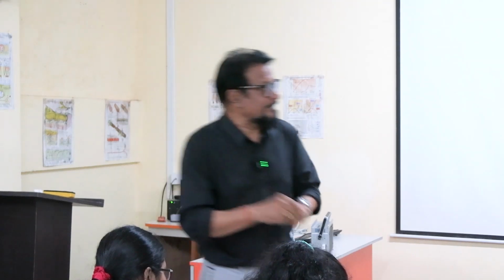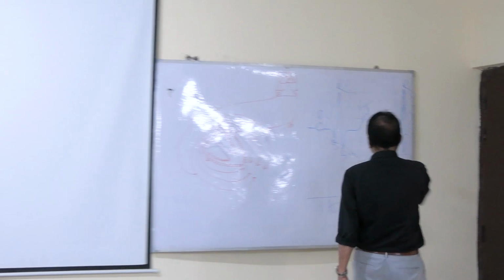When a patient gives a sign or symptom of chest pain, immediately we think of whether the patient is having myocardial ischemia or myocardial infarction. So this will be reflected here.